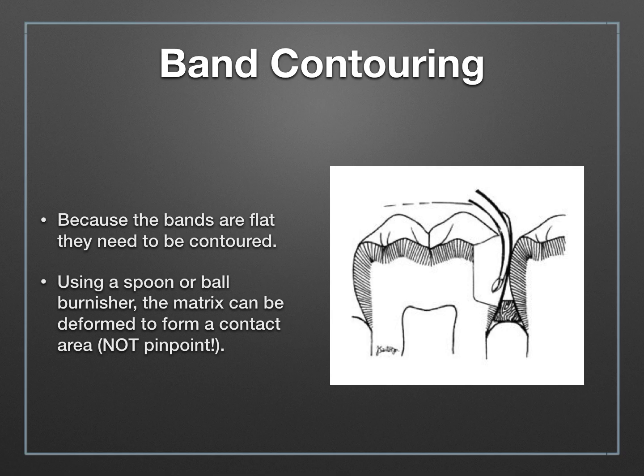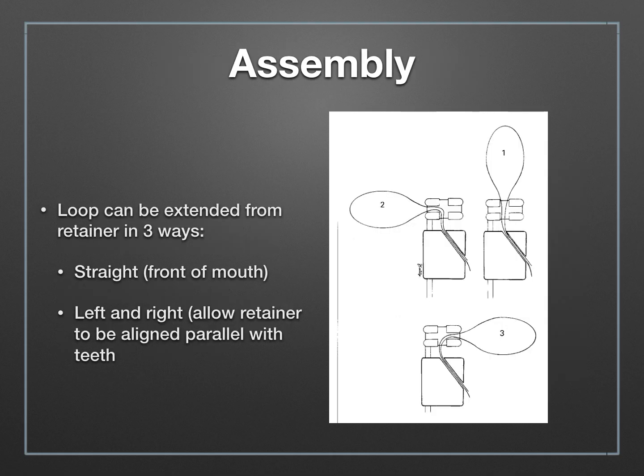With the band in place, we can use a spoon excavator or another instrument to help bend and shape that flat band. When preparing your contact area, it's really important to burnish in where the contact would have been before you prepare the tooth, using a fair amount of force to really deform that band into that contact point. The loop can be extended from the matrix band in three different configurations, which allows you to keep the Toffelmire matrix parallel to the teeth you're working on, so it remains out of your operative field.